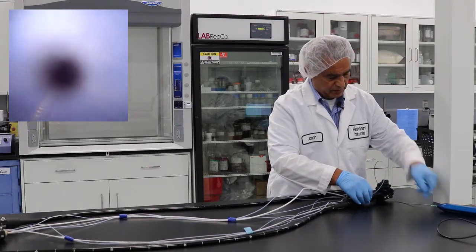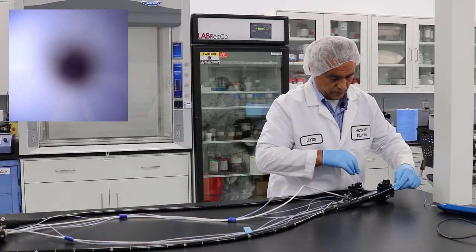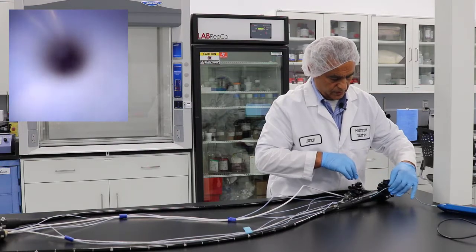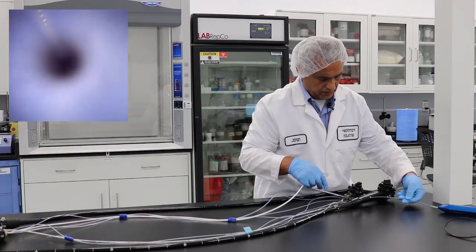Make sure that this is not bending, otherwise you would damage the fiber optic of your flexible inspection scope. Then you advance it. If it is bending, adjust it to make sure that you are not damaging the scope.